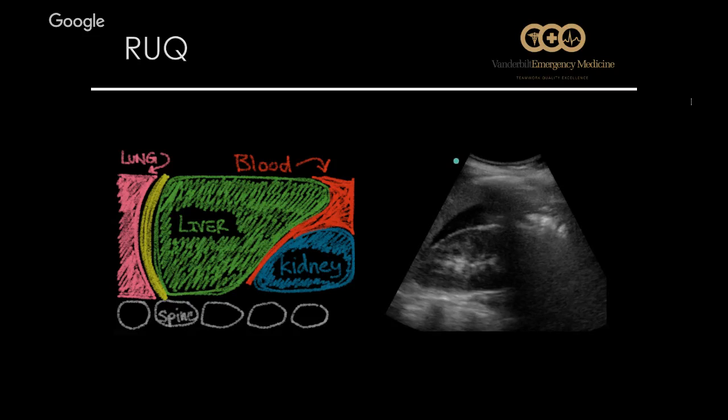So anytime fluid is where it's supposed to be in the abdominal cavity, it's going to have nice, round, soft edges. Think about the gallbladder, the bladder itself, cysts. They're going to have nice, round, clean edges. Whereas free fluid in the peritoneal cavity is going to come to sharp points. So we're looking for that pointy black fluid. Next slide.